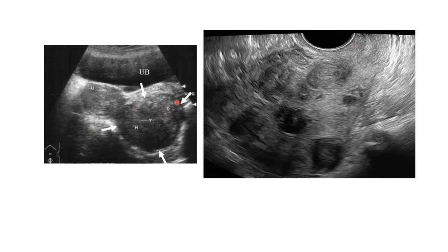So let's have a look here. You can see the uterus there, and you can see there is a fibroid there that is attached to this uterus. So this is a huge pedunculated fibroid. So there's a stalk, there's a connection between the fibroid itself and the uterus. So such types of fibroids are called pedunculated fibroids.